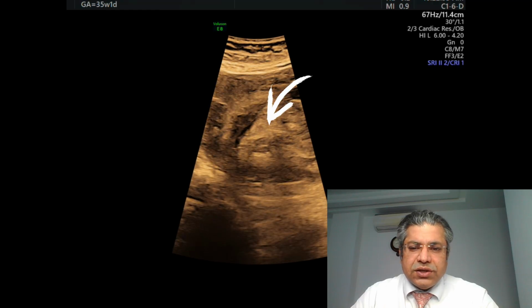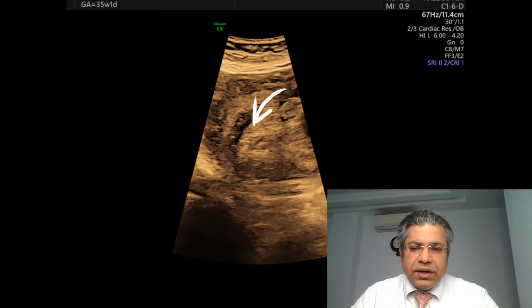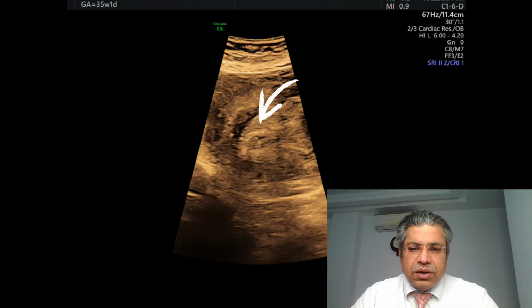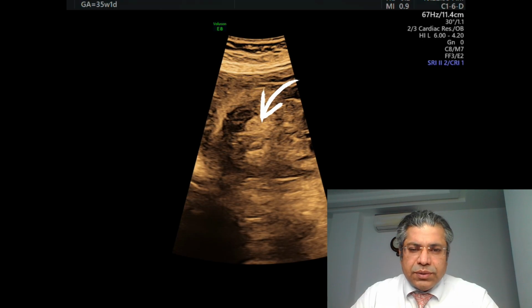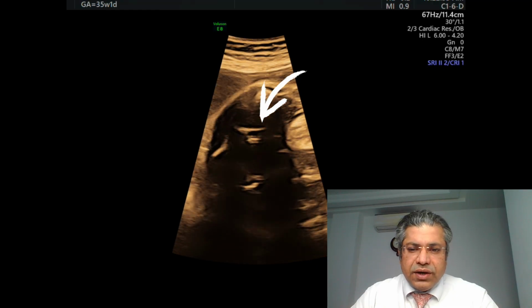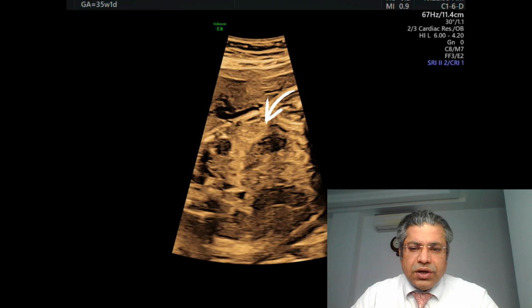So the gut signature is there. The hyperechogenic anal mucosa is definitely there, surrounded by the hypoechoic muscularis. So the anal pit is looked at wonderfully well, and then we go back again and try to look around. The rectum is hugely dilated. Similarly, the sigmoid colon, and we go to the descending colon.